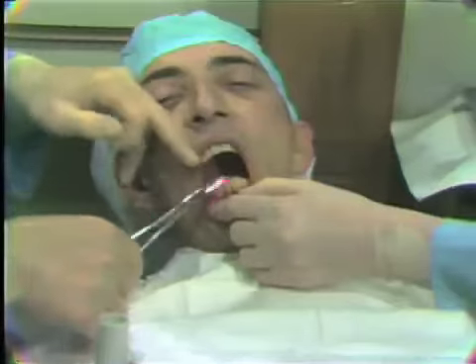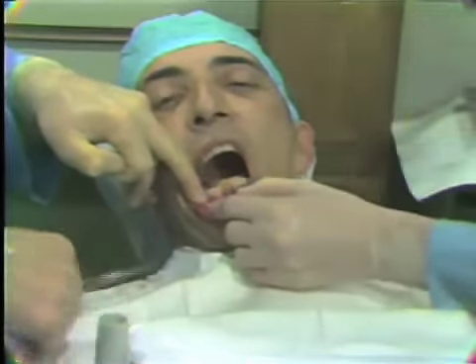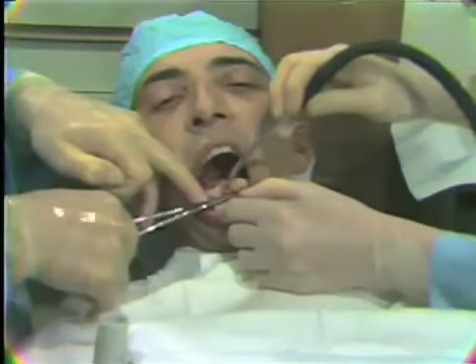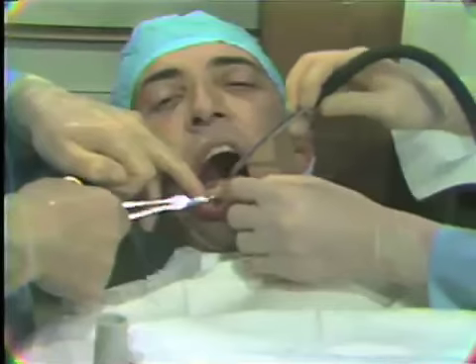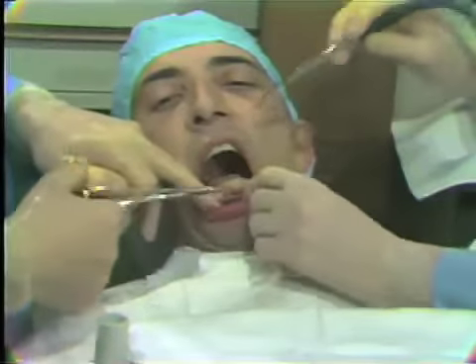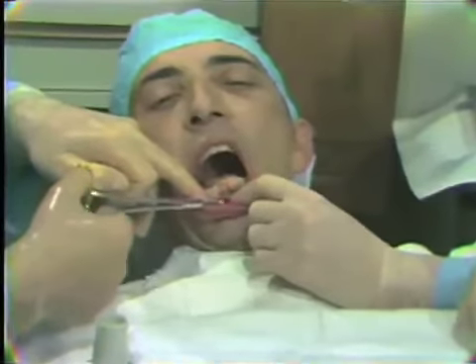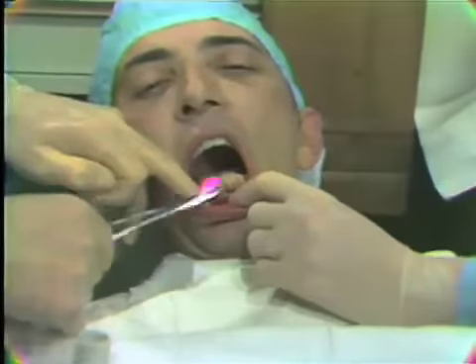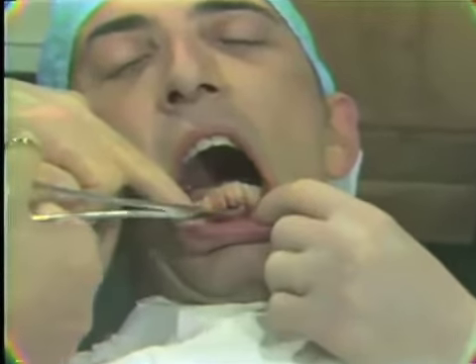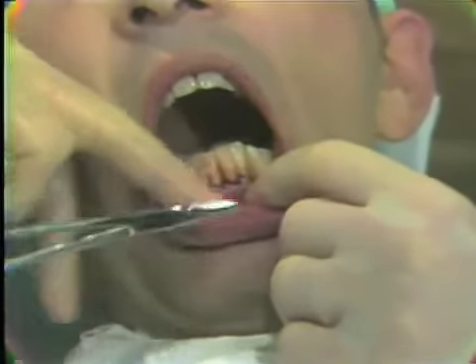I would like to emphasize one point at this time in regard to suture cutting. There's a tendency, I think, to want to cut our own suture. If the assistant is able to cut the suture, we're able then to clearly reflect the lips or the cheeks as necessary. We're able to make certain that these tissues being reflected are not traumatized by a pinch or a cut from the scissors, and the flap then is able to be viewed clearly. The suture then can be cut at the appropriate site.